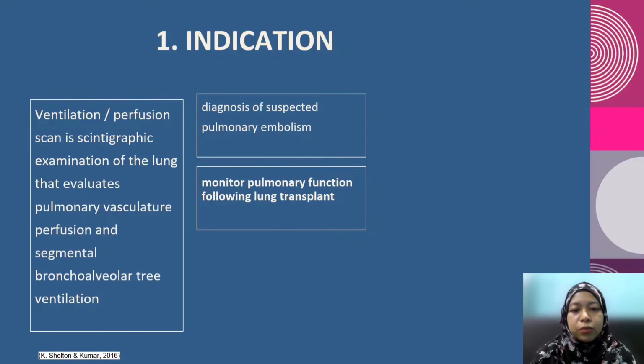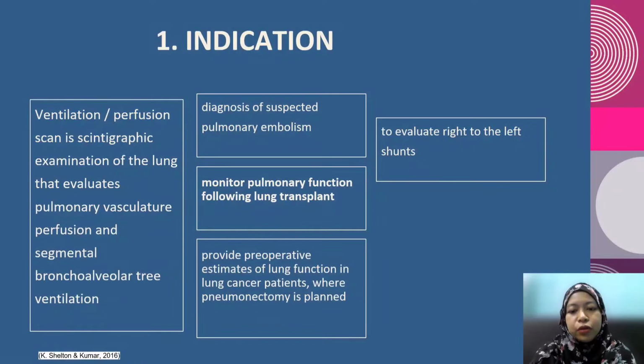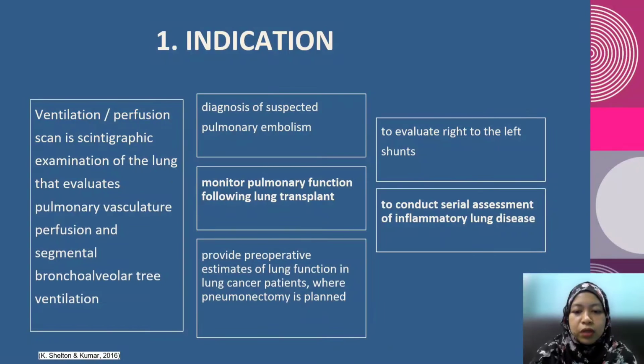This examination is also used to monitor pulmonary function of lung transplant, to provide preoperative estimate of lung function in lung cancer patients when pneumonectomy is planned, to evaluate right to left shunt, and to conduct serial assessment of inflammatory lung disease. Next, technique.